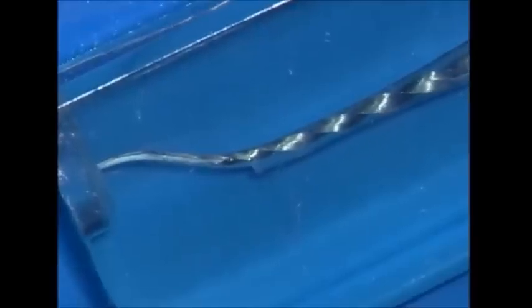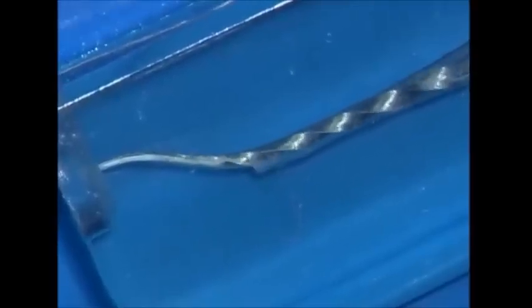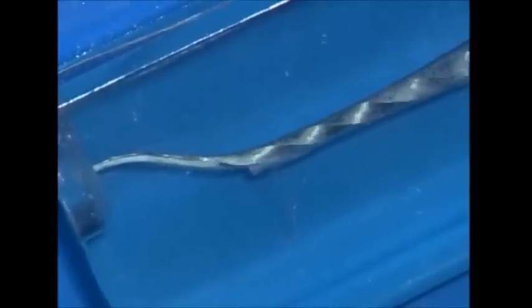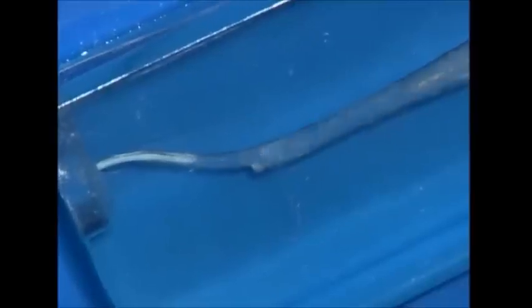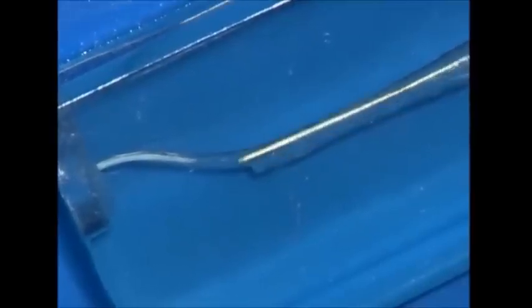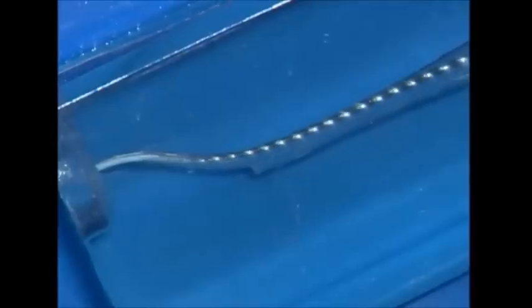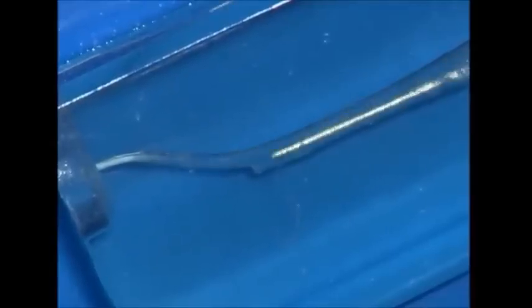A clockwise rotation moves this instrument in, and its 7% taper begins to carve the shape in the apical extent of the canal. The instrument is worked until it achieves length. Following its use, we irrigate and recapitulate and re-irrigate to liberate the debris from the canal. Move the 10 file in short amplitude strokes to encourage debris removal.